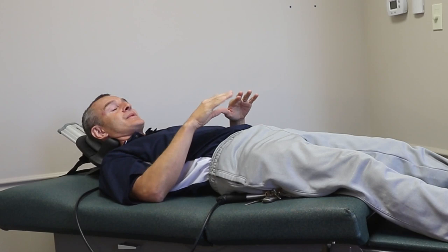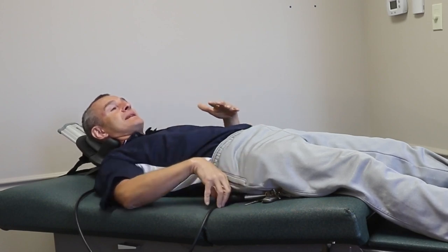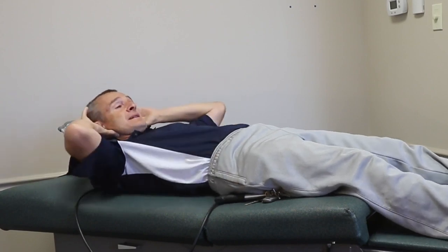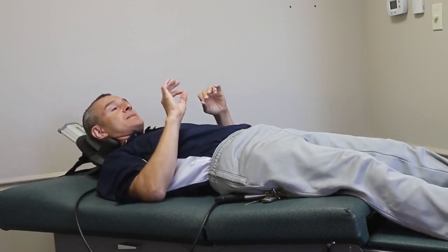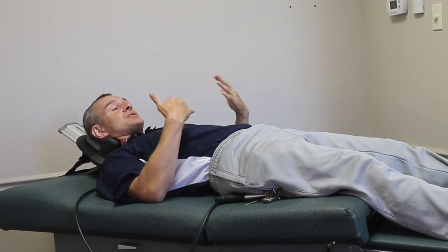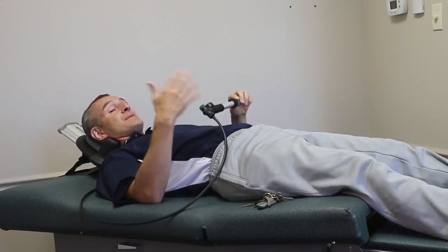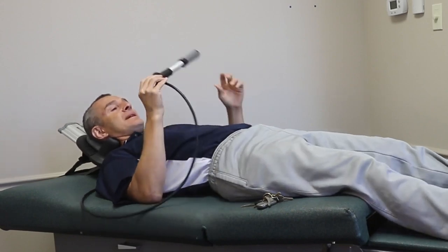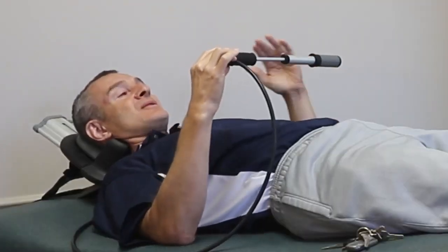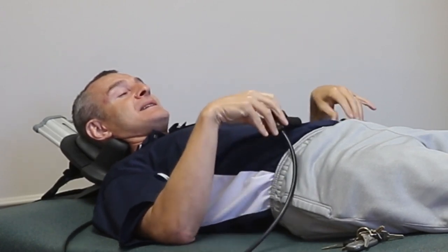Most times I will ask a patient to just lay in this position without even pumping up the handle or anything, because the little bit of flexion that happens in the head will already start to open up the canals in the posterior aspect of the spine, possibly start to decompress just by doing this. Now once I've laid in this position one to two minutes, I'm speeding it up for the video, I will go ahead and start to pump. As I pump right there, I felt just a little bit of movement. If I look at the gauge, I've got 5 pounds of pressure, and it's perfect.